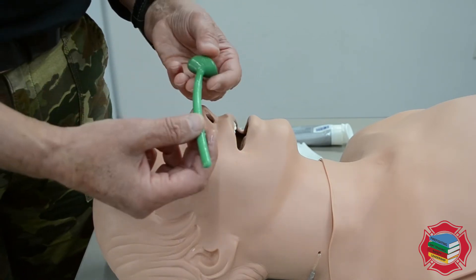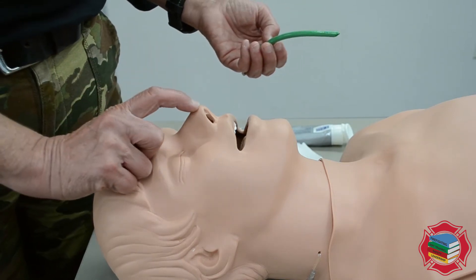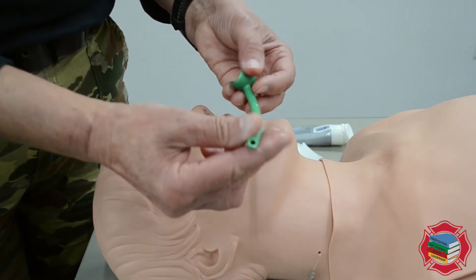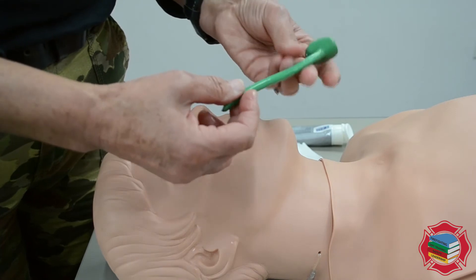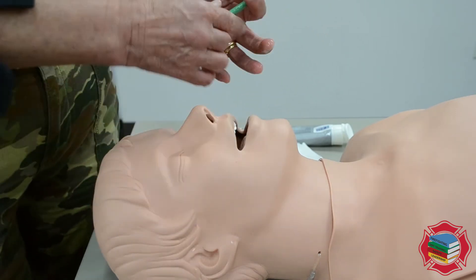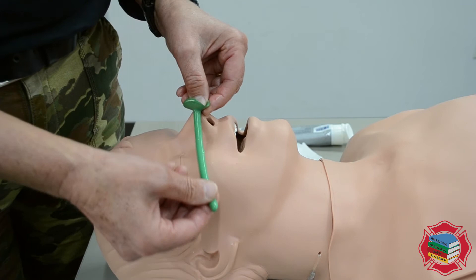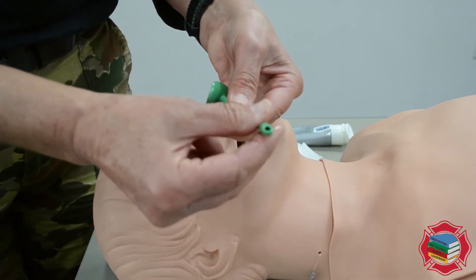These NPAs come in various sizes. This size actually fits this mannequin. When you measure them, there are two measurements: one is from the tip of the nose to the earlobe or the angle of the jaw. You also have to measure the diameter of the airway because it has to fit into the nare. So when you measure the NPA, it's from the tip of the nose to the earlobe or from the tip of the nose to the angle of the jaw.